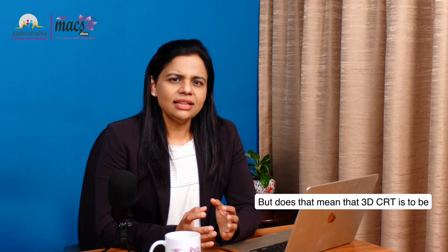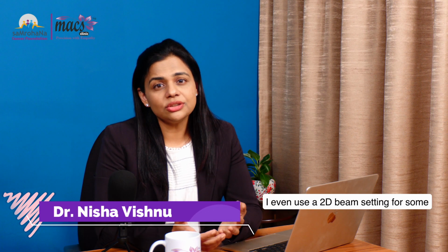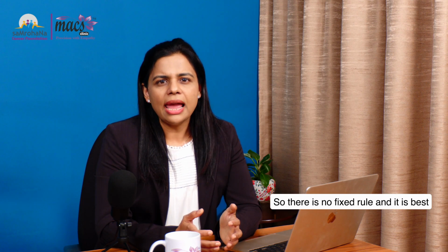But does that mean that 3D CRT is to be completely thrown out of the window? No, of course. I still use 3D CRT very successfully in some of my breast cancer patients with very little side effects to the heart and the lung. I even use a 2D beam setting for some palliative treatments now and then. So there is no fixed rule, and it is best left to your treatment team to take the call after discussing with you.